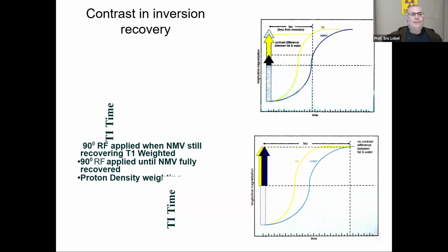So without sounding a little hypocritical, in CAT scan, and of course, just about everything you can do in CAT scan, you can do in MRI. In CAT scan, you can also do what's known as a MIP, or maximum intensity projection, which is turning individual pixels on or off. So for instance, you want to do a CTA, a CT angiogram, and a vessel zigzags on top of a bone. The bone appearing bright would get in the way of the vessel also appearing bright. So if you could turn the bone off and make it black, then you see your vessel.